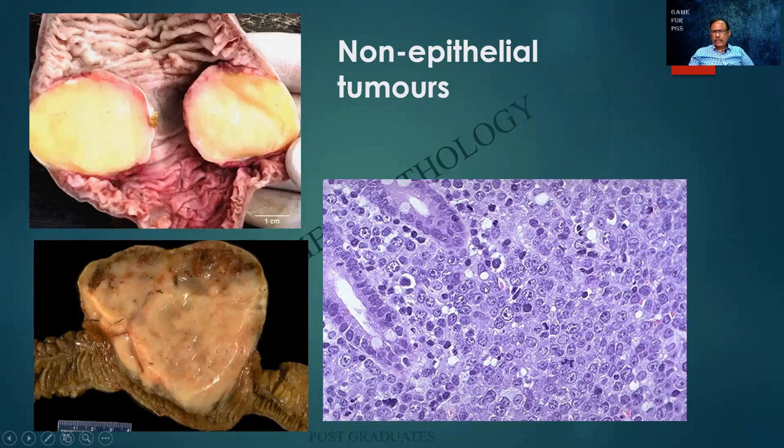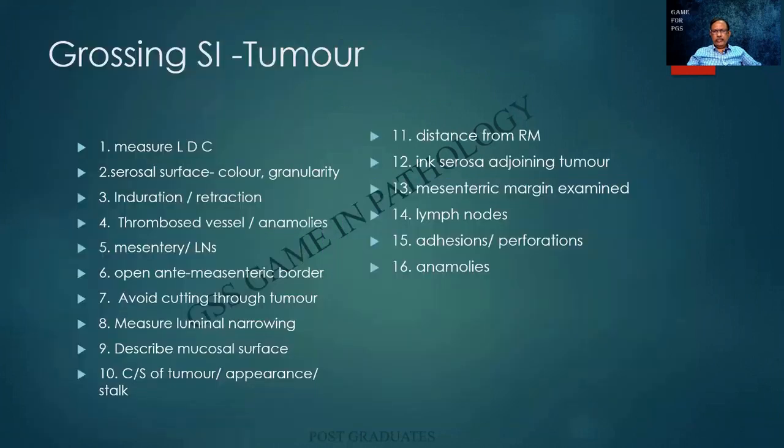And when I see it microscopically, there is a homogeneous architecture. There are no follicles that could be seen and increased amount of mitotic figures. A non-Hodgkin's lymphoma. Extranodal lymphoma by itself is a question for you people. Galtoma, maltoma, etc. And the associated IHCs you people can read up. So these are all the various methods by which you people will have to cross again.